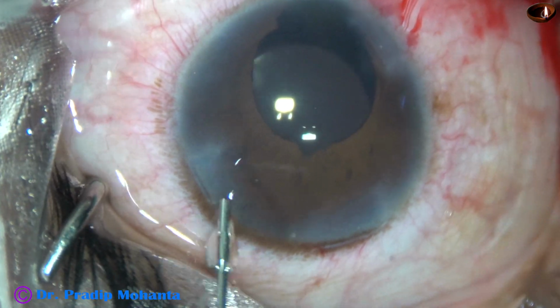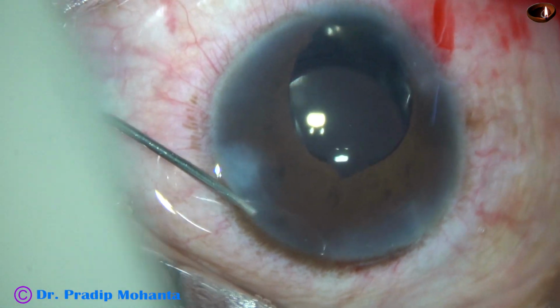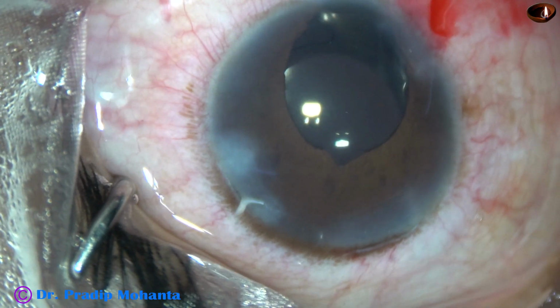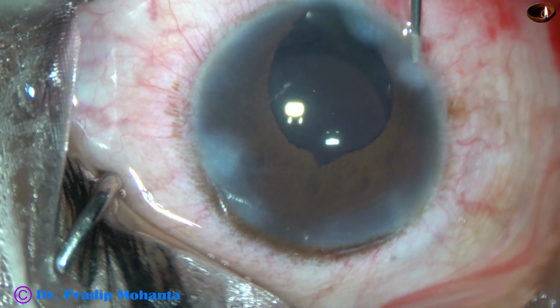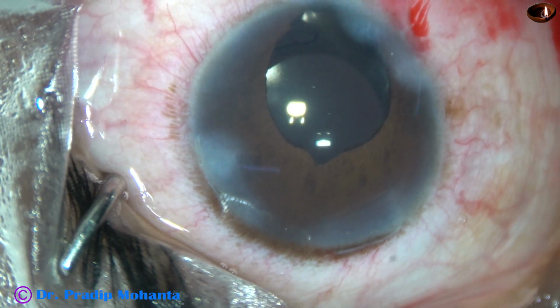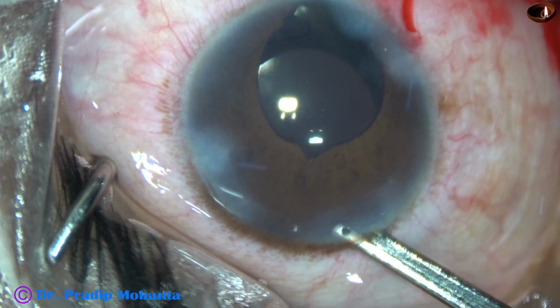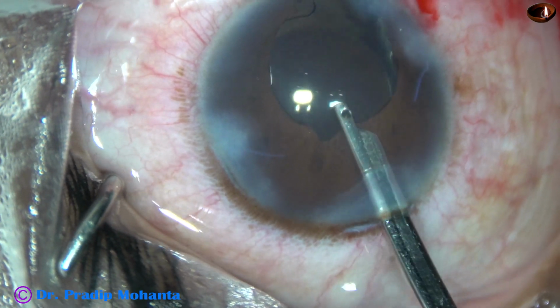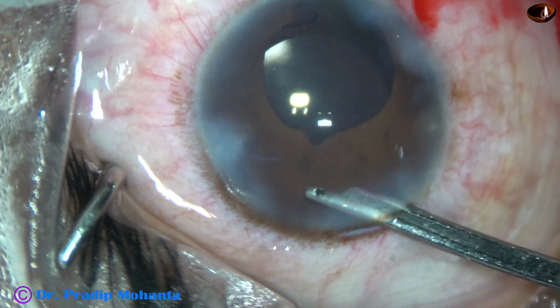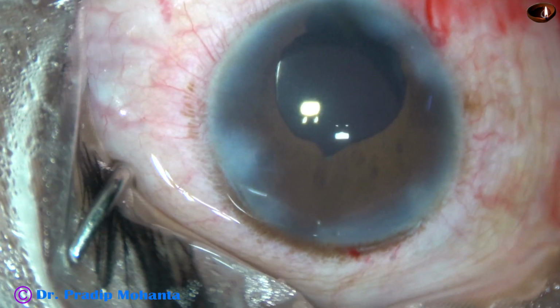We are towards the end of the surgery. The side ports are closed by stromal hydration. In such cases, if the zonular dehiscence is little more, we can use a CTR in the middle of the surgery. This is the final lavage of the anterior chamber. See, the pupil has constricted, but still the upper margin of the pupil is not covering the visual axis.